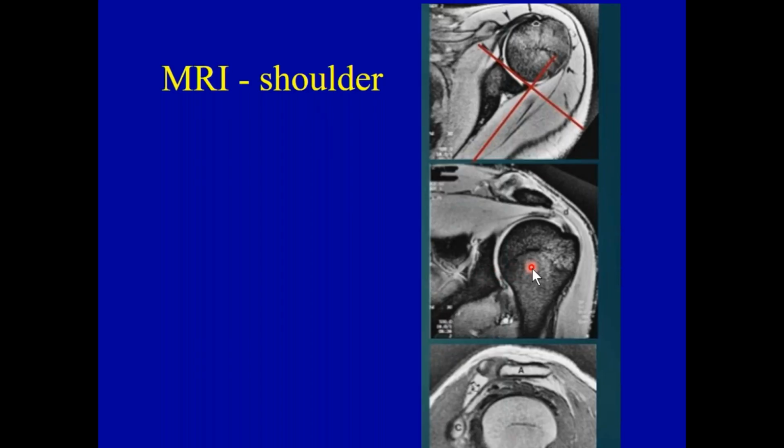So if we took this image, which is an AP view, but in the MR world the lingo is coronal. Imagine a slice of bread that is turned and faces you towards the chest. And so now the slices are oriented in a particular fashion. So we can have that loaf of bread sliced in different planes. This happens to be the coronal plane. But the anatomy doesn't change.